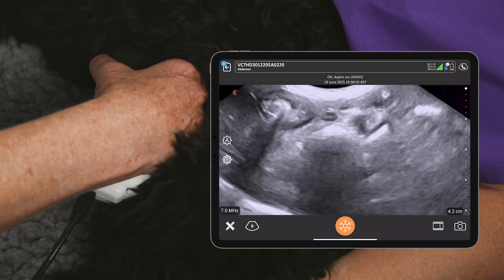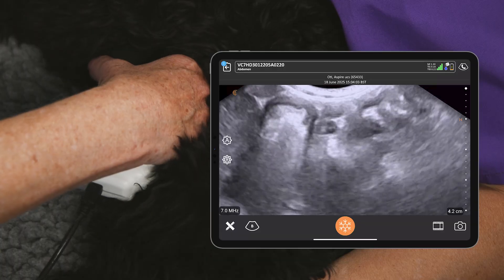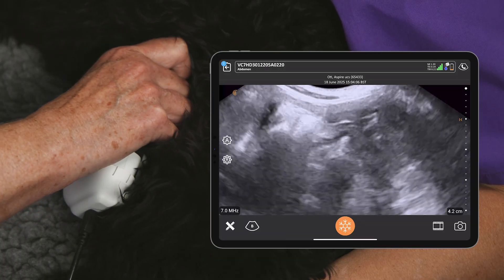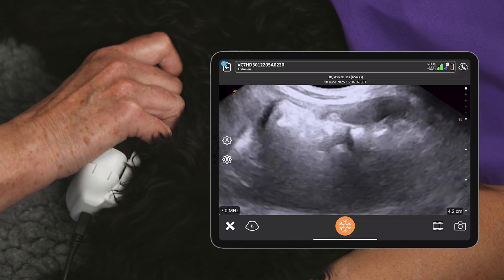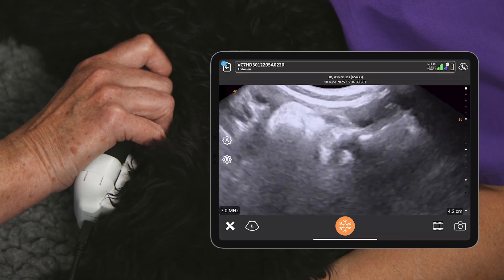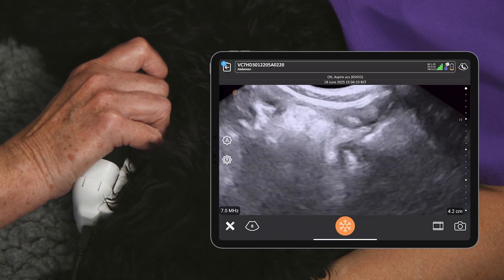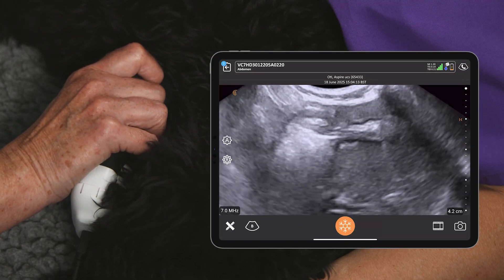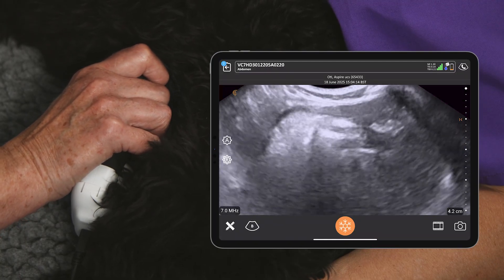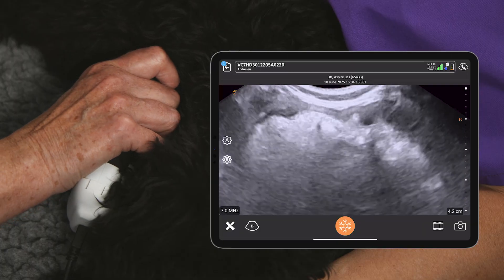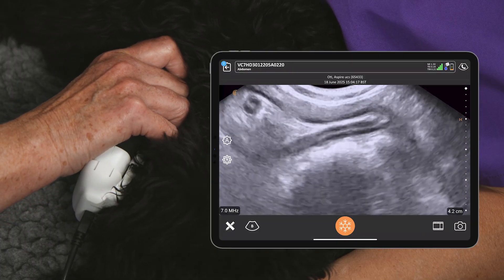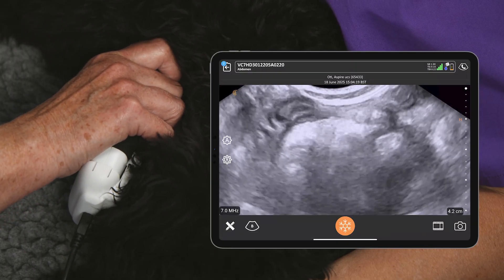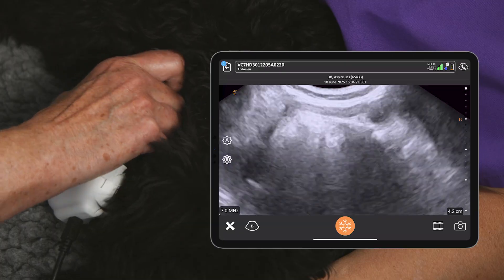Looking at the stomach in long axis is quite difficult because when you rotate on it, the rugal folds tend to become quite stripey when the stomach is empty. I find it much easier to assess wall thickness in short axis, but it's still important to look at all of the stomach in more than one plane.